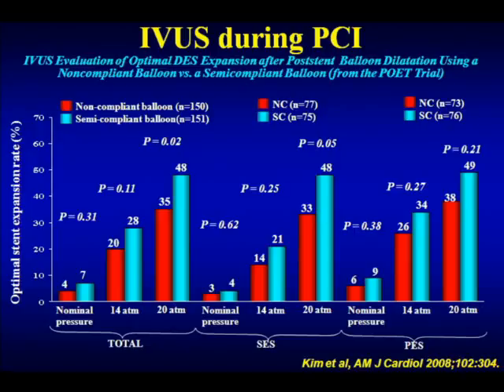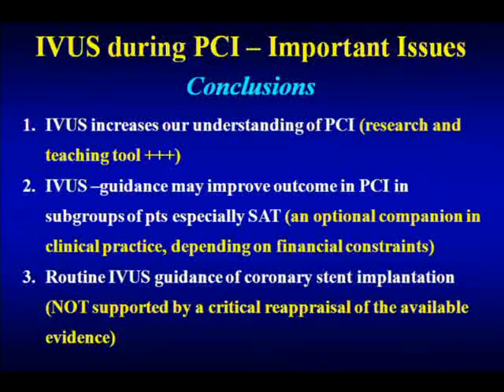So I would just want to conclude here that IVUS increases our understanding of PCI. It's not only a research and teaching tool, but it makes us understand PCI a little more than just by an angiogram. IVUS guidance may improve outcome in PCI in subgroups of patients, especially the issue about stent thrombosis, and that's very, very important, by optimal stent expansion.